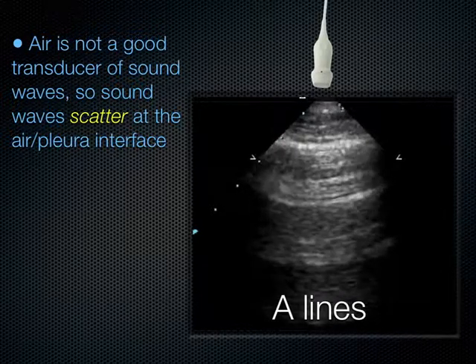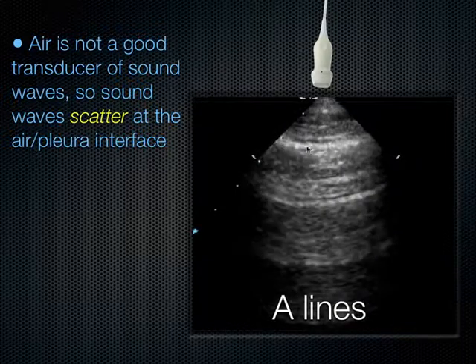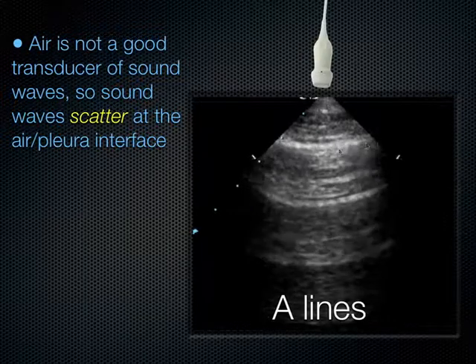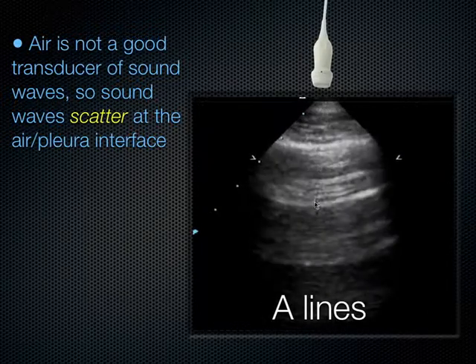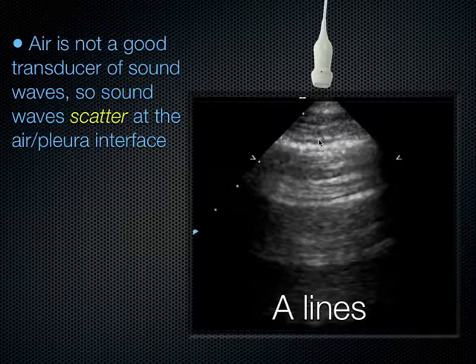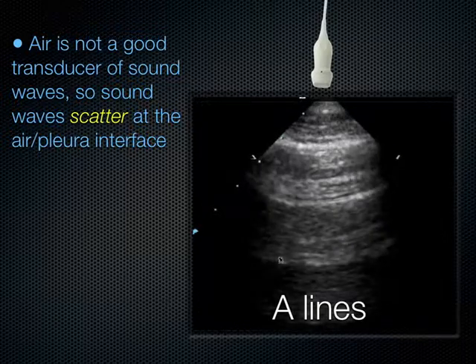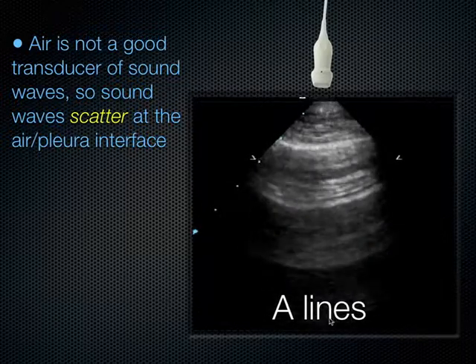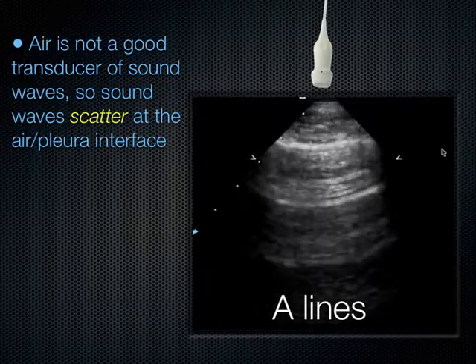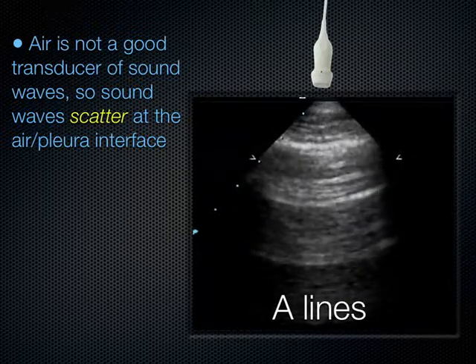But I love seeing this again. Here's the skin line. We come down. This is the VPPI. It's sliding back and forth. It's sort of subtle there. See that sliding right there? That's the lung up against the chest wall sliding back and forth. At an equidistance, I see another A line down here. This is the VPPI. This is the A line here. And then an equidistance from there, I see another A line down here. And if you strain your eyes, maybe you can see another one down here. Okay, so this is in the normal lung. We see these A lines sliding back and forth. We'll also see A lines that don't slide in the setting of a pneumothorax.